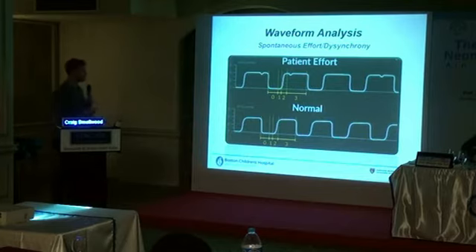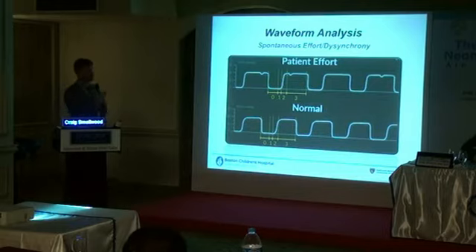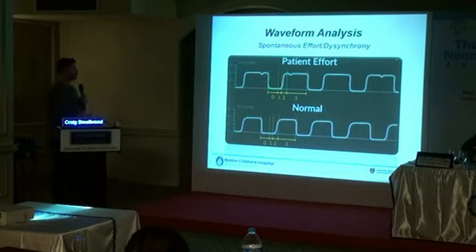In order for them to generate a negative pressure or a flow difference during ventilation, a lot of those breaths can be missed if the respiratory effort of our patient is too subtle to trigger the mechanical ventilator. In that context, we can adjust the trigger sensitivity. Usually we use the negative pressure and/or the flow trigger. You don't want to auto cycle: if you set it too sensitive, the ventilator could be tricked into thinking there's always an effort. You also don't want to be too insensitive, so that we miss these breaths. These missed breaths we can pick up on the capnograph as well as some of the ventilator graphics. This is what it may look like.